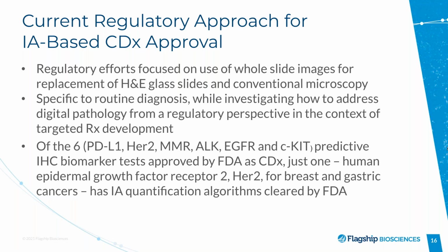So it's predicted that this process will just expand, and it's all based on the rigor of the quality standards of testing and reproducibility and reliability, starting from analytical validation and ending up with the clinical validation and demonstrating the performance of the companion diagnostic. It is also very important what the contribution of image analysis is to informing the clinician for making some critical medical decisions, and it's all about the risk.